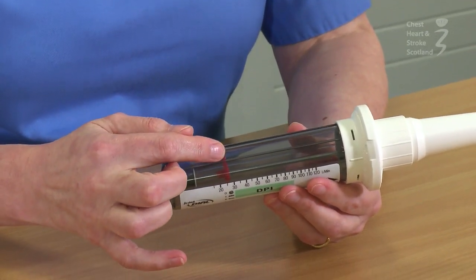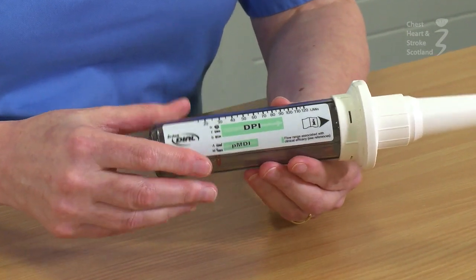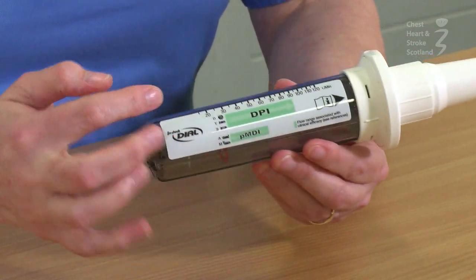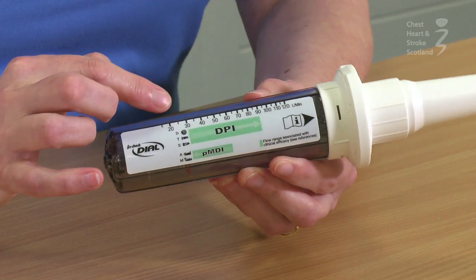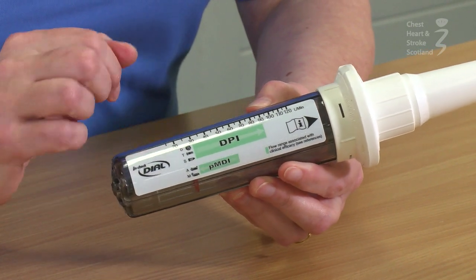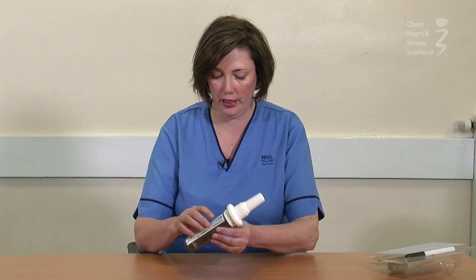You then check the red wheel is in the green zone. In this case, we can see that the wheel is not in the green zone, so therefore we can try again and encourage the patient to breathe a little bit harder.